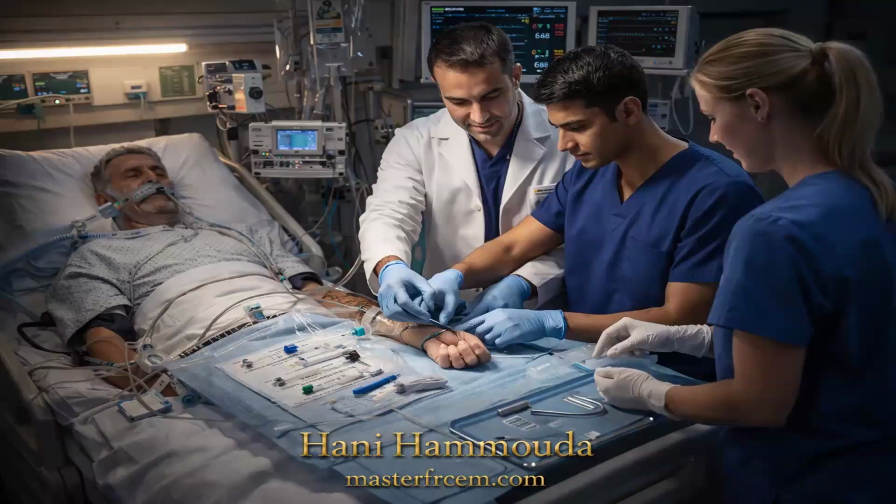And then moving on to the preparation for the procedure. For you to do this procedure, you have to have an assistant, at least 2 people, the doctor doing the procedure and then the nurse to assist. Prepare yourself. It's an aseptic procedure. Put on your PPE, wash your hand and put on your PPE.